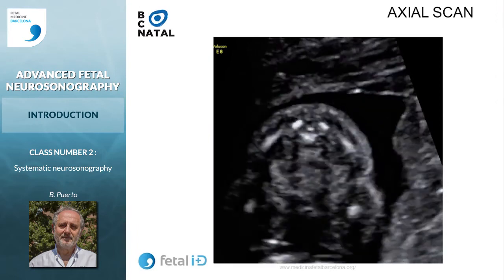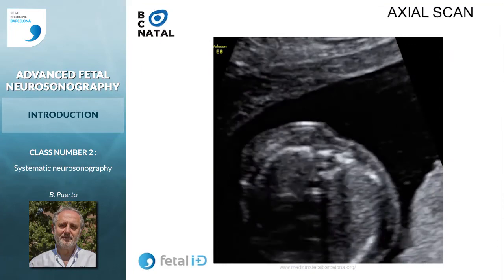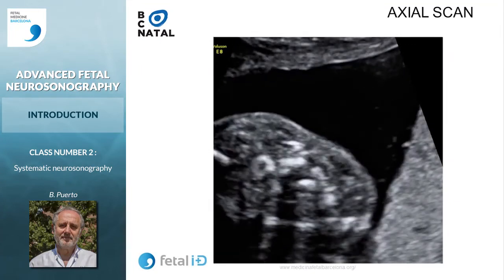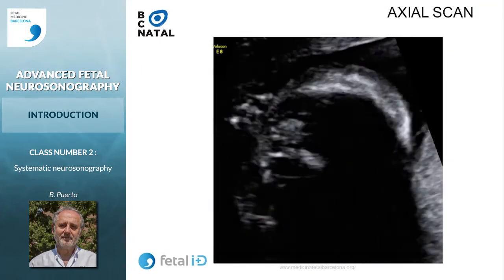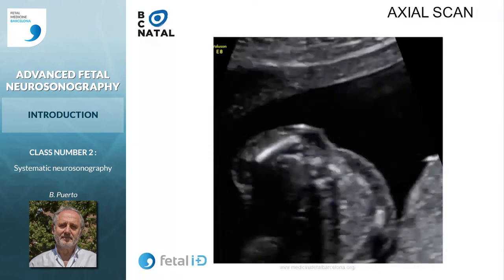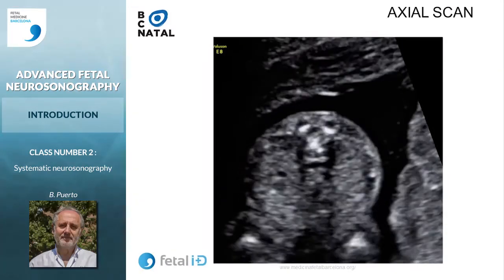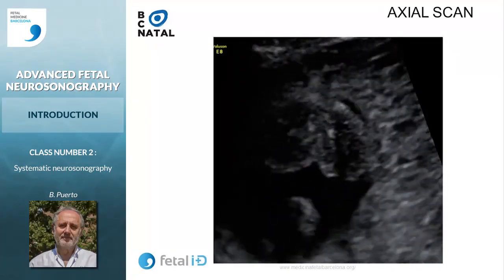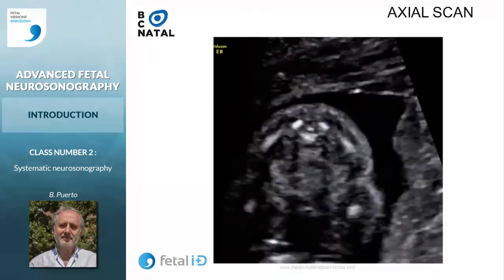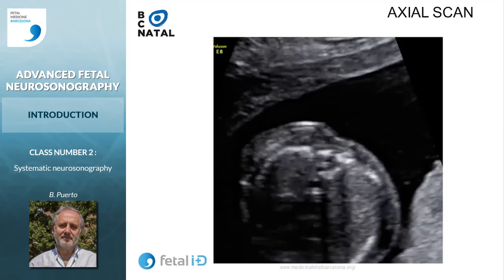Then, we end with the axial plane, with the spine anterior. Here we can see perfectly the closure of the medullary canal with the lateral processes. We also see the vertebral canal, which has different morphology descending along the level of exploration. We have to confirm the integrity of the skin and the vertebral muscles and the presence of the medulla.